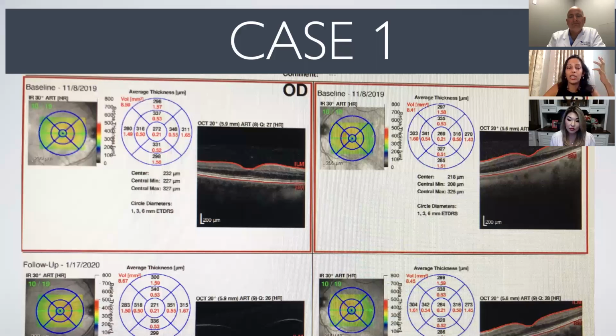And one of the interesting things is I used to do the topography and the slit lamp and the ocular surface check, and then I sent the patient out, and on a different visit, their pre-op visit, I did the OCT macula. But I actually found that here I am spending all this time talking about different lens options, and then if I had known what I knew the next visit, I wouldn't have even gotten into it.